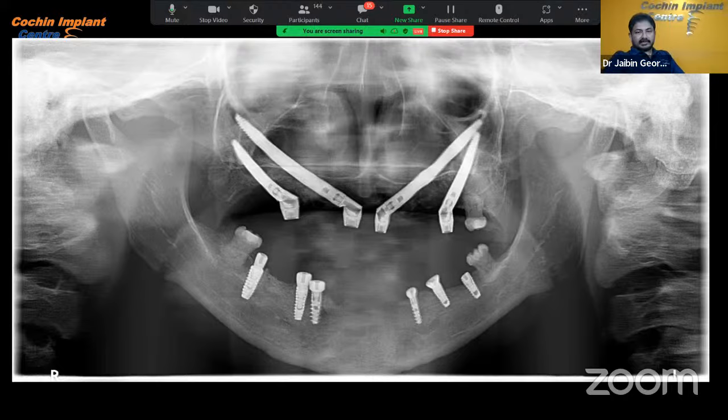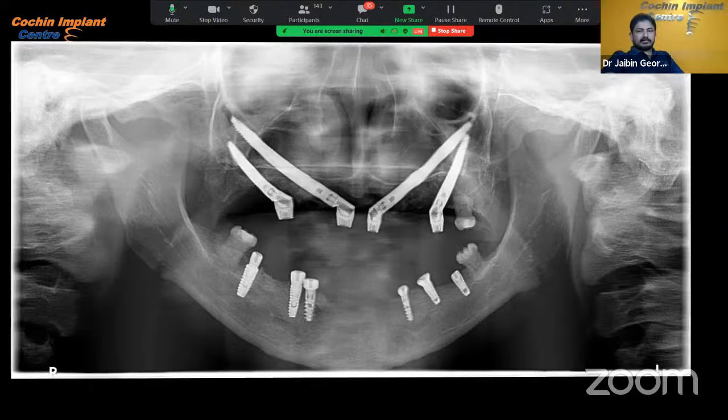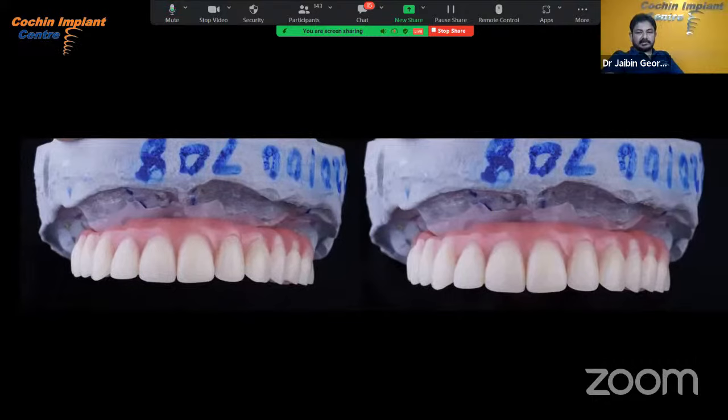So only with extramaxillary implants, we manage the case. Lower, we placed conventional implants. And in this case, we have given a metal acrylic prosthesis. This is the prosthesis we made on the second day after surgery.